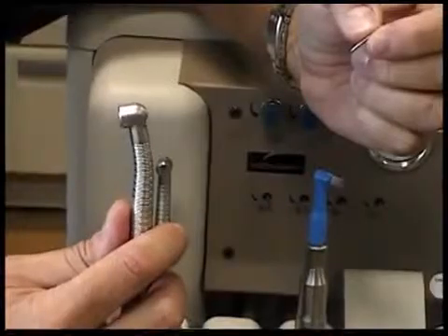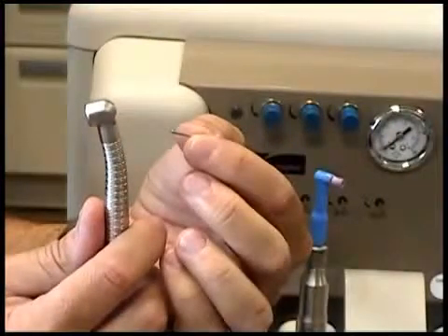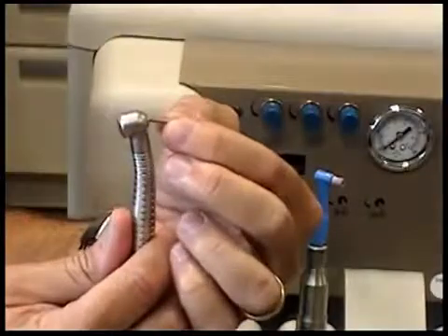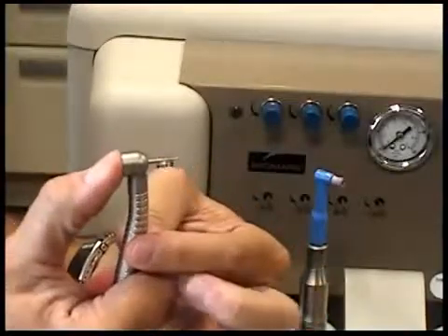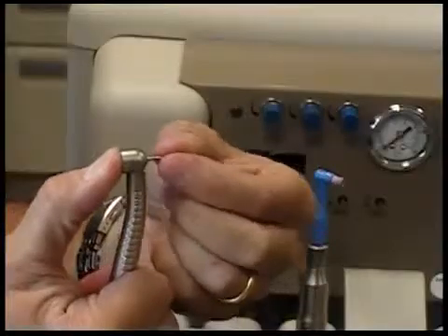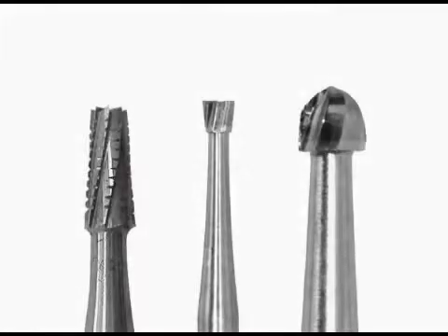Next, we put a burr in the high-speed head by taking the following steps. With the smooth edge of the burr facing toward the high-speed handpiece and the rough edge facing out, push the burr into the head. Once the burr has gone as far in as it can go, push the button on the back of the handpiece head firmly. While holding the button in, push the burr in as far as you can. Release the button.